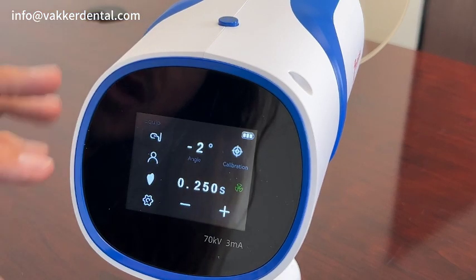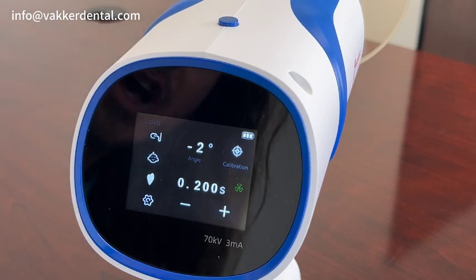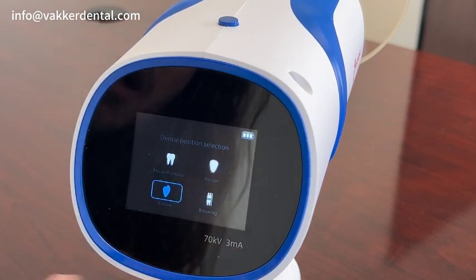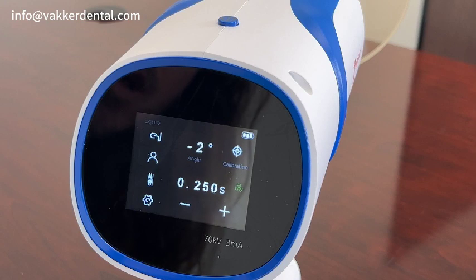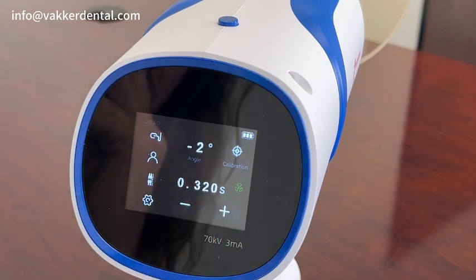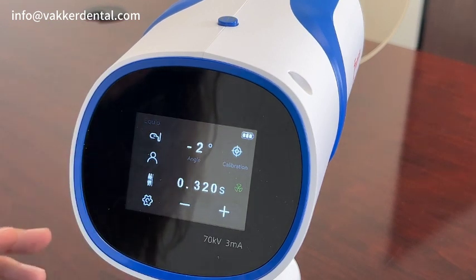Going back to the home screen, the next option is we're going to choose either adult or child. Then the third option is going to be what type of exposure you're taking — bite wing, premolar, canine, incisors. We'll go ahead and choose bite wing. Here's the exposure setting, and you're able to adjust it accordingly — you can raise it or lower it depending on what type of sensor you're using and what type of shot you're trying to take. That's very straightforward on how to operate the unit between its different settings.